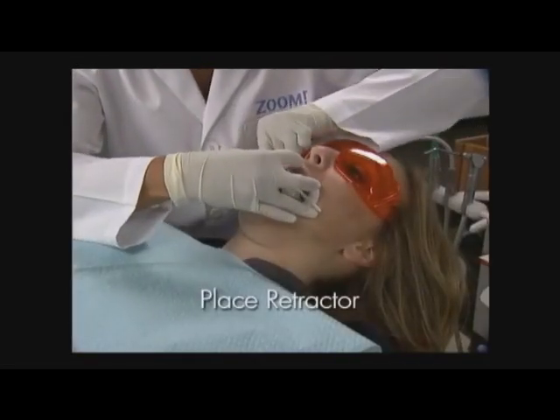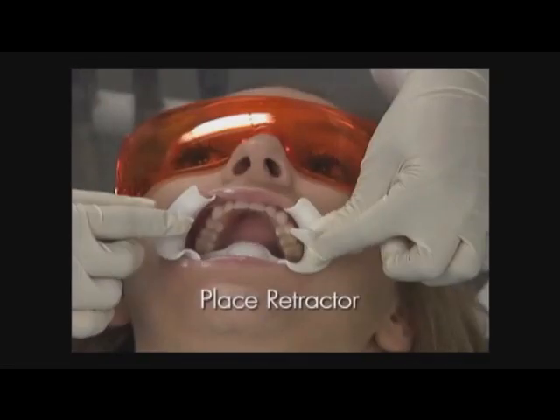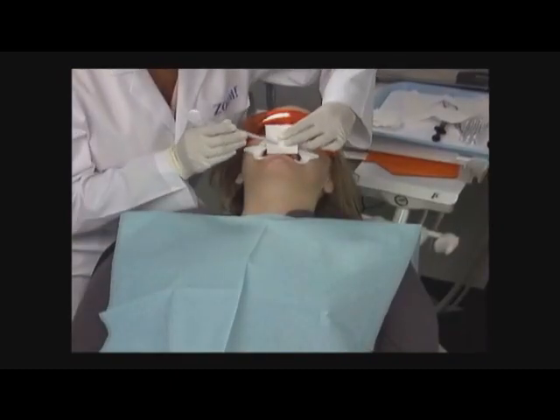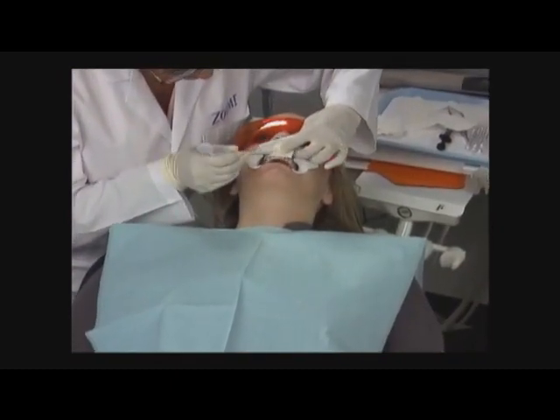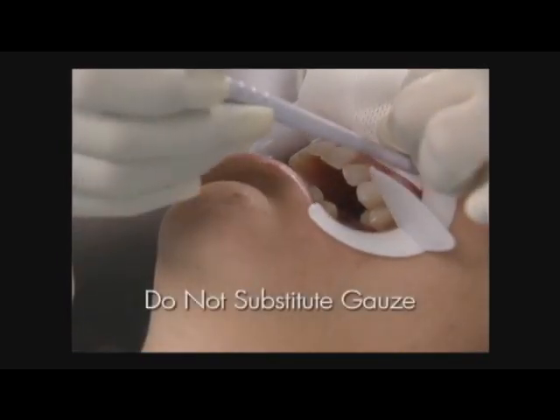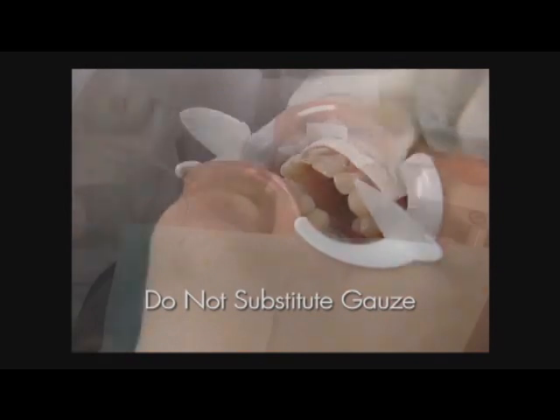Instruct the patient to rest their tongue behind the tongue cup and to lightly bite down. Isolate with the 2x2 gauze included in the ZOOM kit. This gauze has been tested and is proven to provide superior protection with the ZOOM lamp. Do not substitute your own gauze for this procedure.